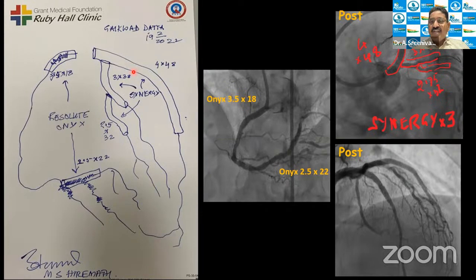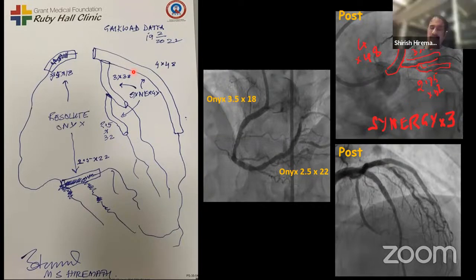But unfortunately, you had some trouble which was noticed later, but still the stent tracked so well, and you could place the distal stent so that flow is maintained well. Because in such complex cases, if one place gets into thrombosis, everywhere could land into trouble. I think that was an excellent demonstration, great case, sir. Thank you for showing this. Thank you, Srinivas.